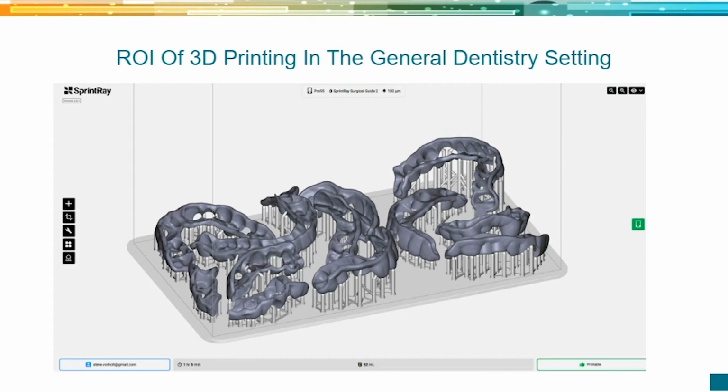So I'm doing 10 or 12 guides for about 40-50 bucks in total cost to me. So we're getting down into the couple dollar range per guide, and so that profit margin is really nice. And if you have to print several models, or print extras, it's not a concern, right? So the return on investment is there for sure.